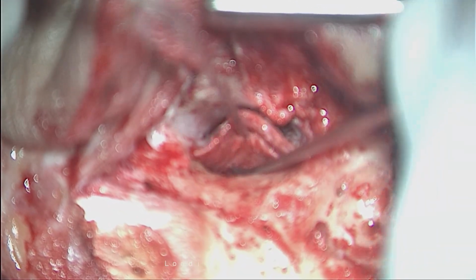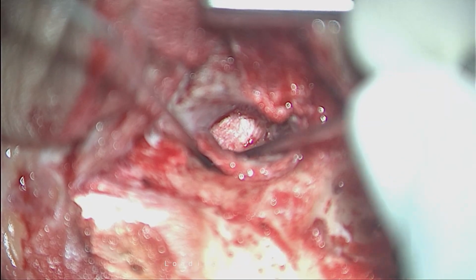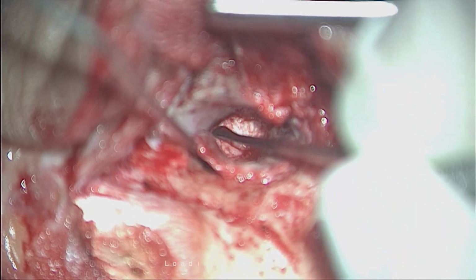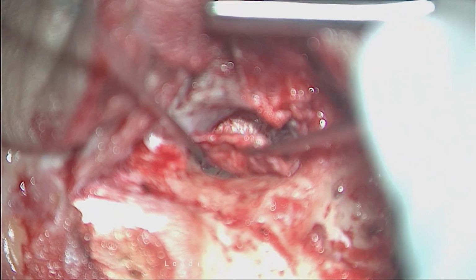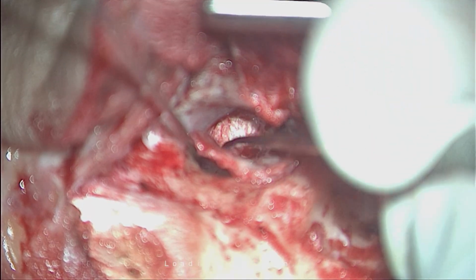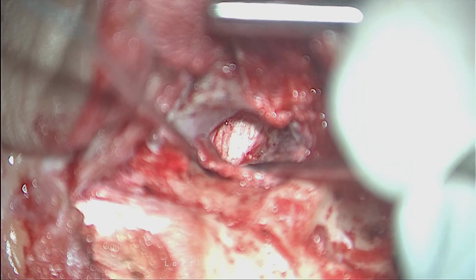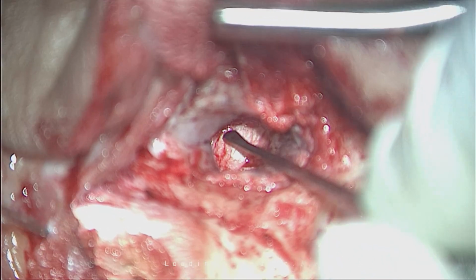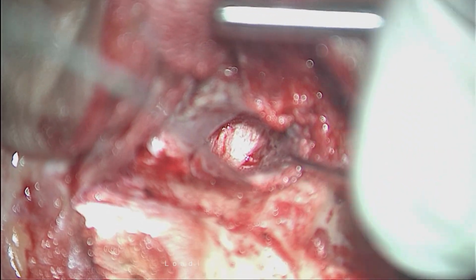And see, there is no support in the middle ear needed. Once you have compressed the periphery all around and all these layers are in place, no gelfoam or anything which may interfere with the aeration is required. Nothing is required, no support is required at all. And I am tightening all around, like we tighten a tennis racket from the periphery.